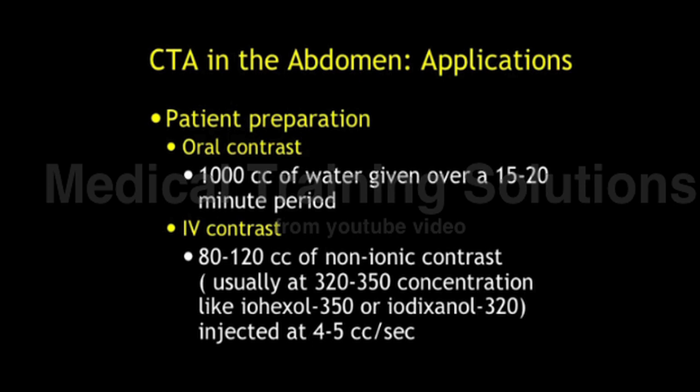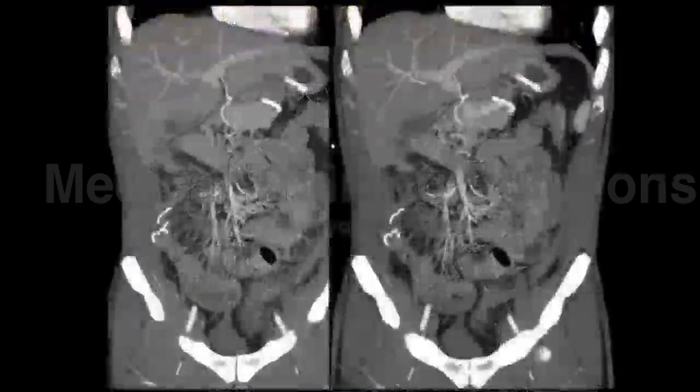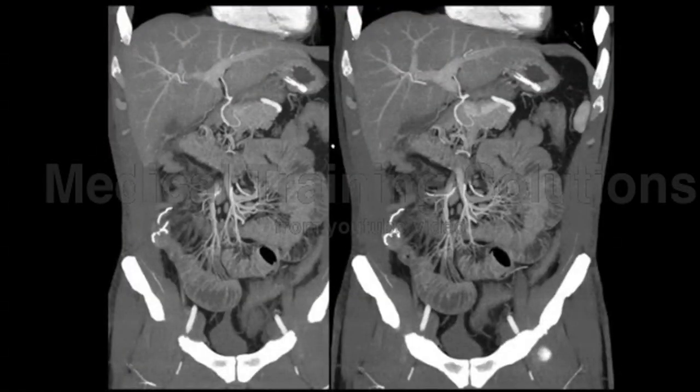And here's just one nice example of water as a contrast agent. You can see the patient does have a stricture in the distal small bowel. There's some surgical clips present, very nicely shown on the volume rendered images. And this was a patient with Crohn's disease with an area of recurrent disease near the anastomosis with some mild obstruction at that point. And of course, you go from volume rendering to MIP to get a little better look at the mesenteric vessels and the distal vasa recta.